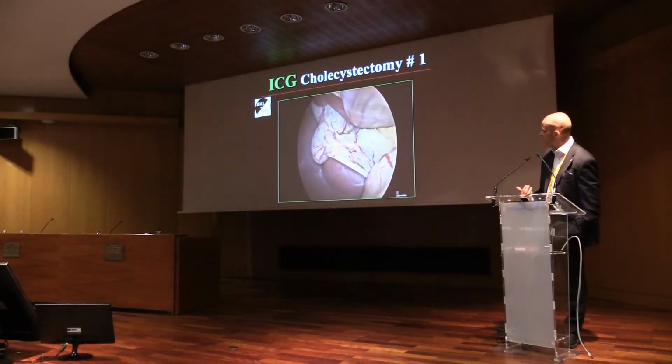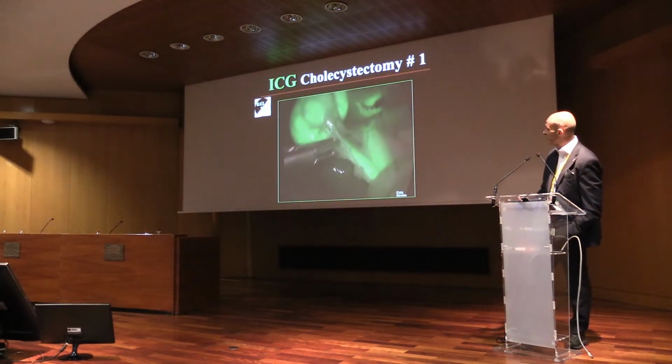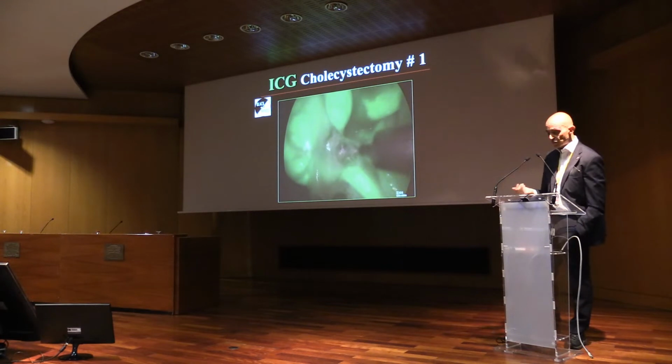You can see this is standard view. You switch with the pedal. As you can see, the anatomy is so clear. You can see the gallbladder, the cystic duct, and the main biliary tree, and you can dissect the fatty tissue without risk.